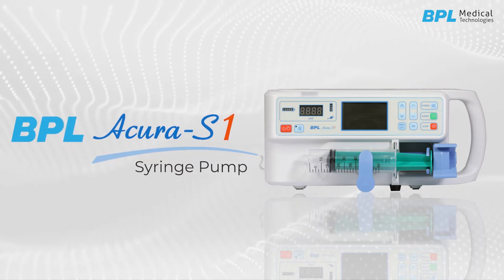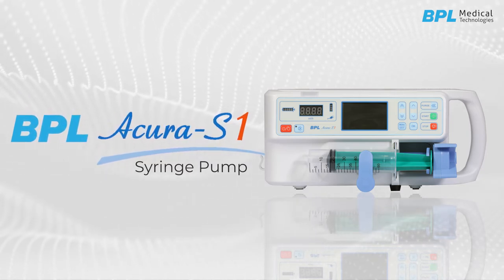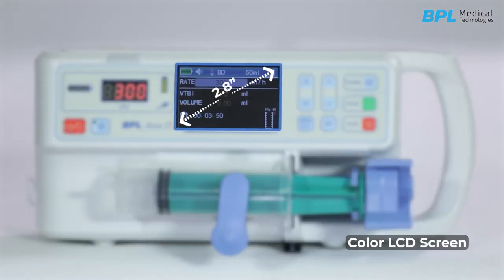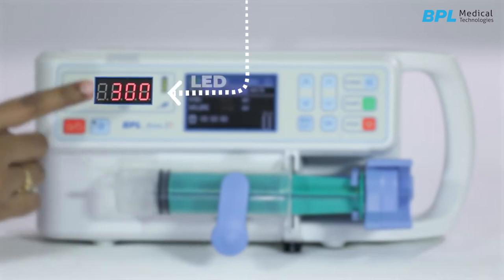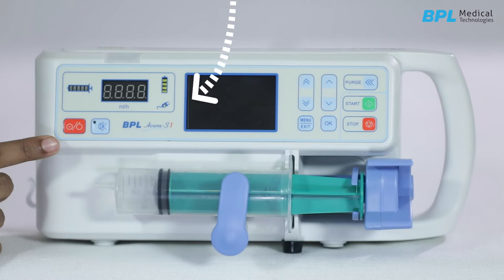The BPL Acura S1 syringe pump is a fully featured syringe pump suitable for critical care and general infusion applications. The pump has a 2.8 inch color LCD screen and has an LED which shows the set infusion rate. This is the power button to switch on and off the syringe pump.